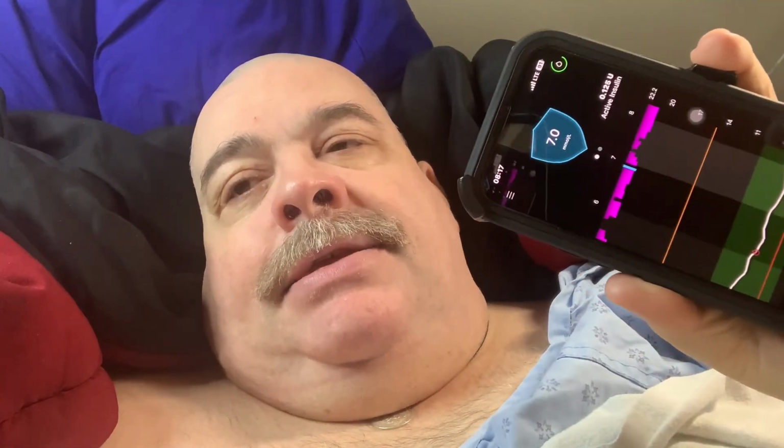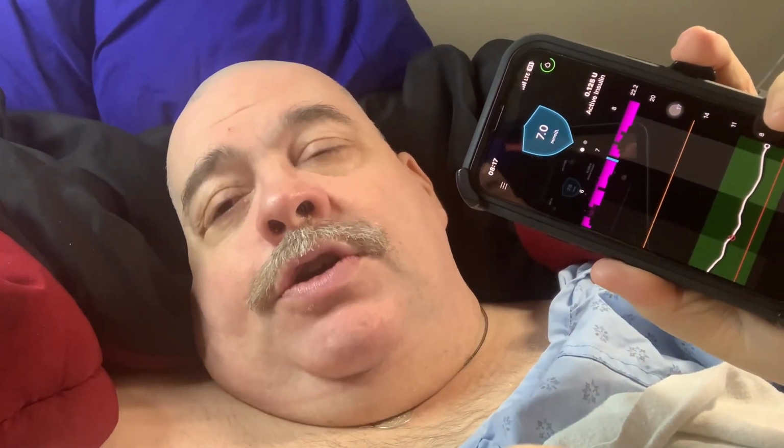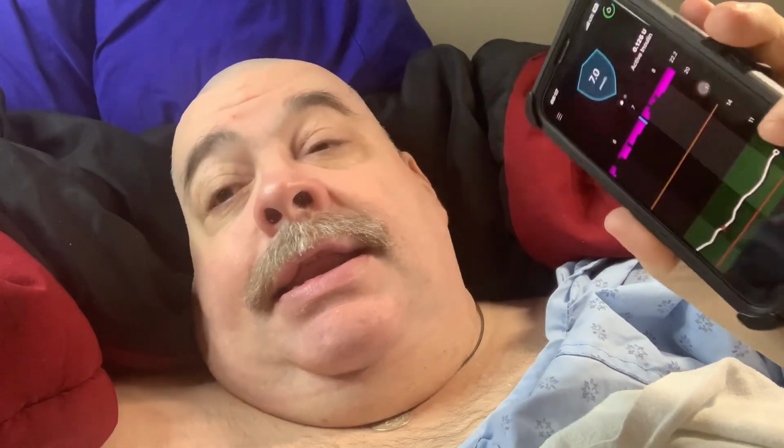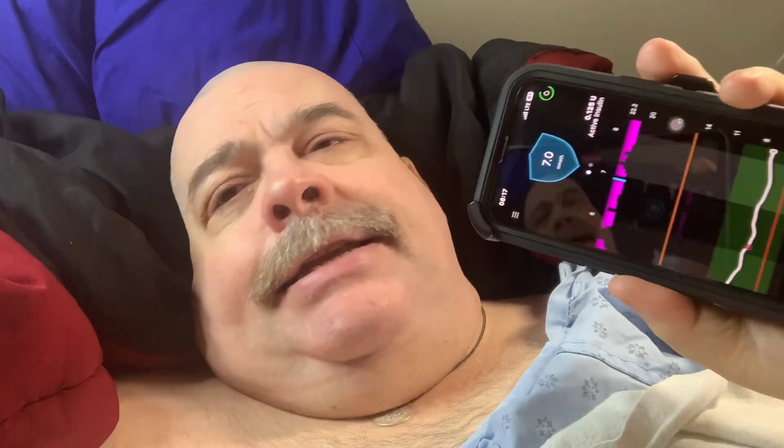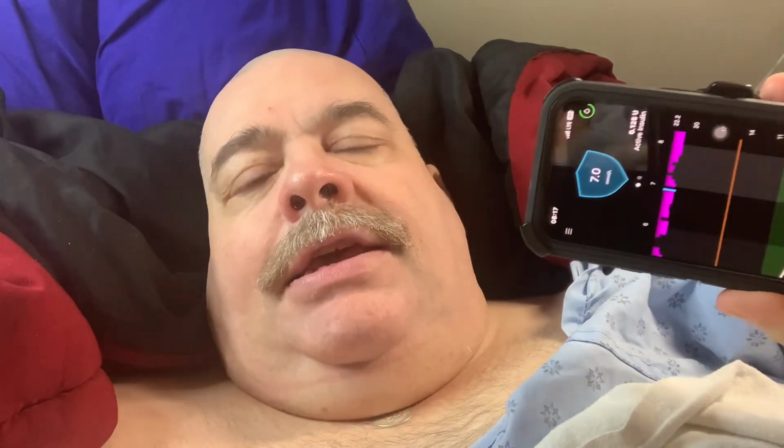Now, with the Medtronic, which I use, there is a 7-day turnaround. You're going to have to insert a new sensor. It is easy to do, I will say that. But it's not the sort of thing where you put it in and that is great. There are companies out there that are developing, I believe, a 3-month permanent sensor. But again, you'll have to make a doctor's appointment to get it changed. So there's always a negative to any sort of pump and sensors.